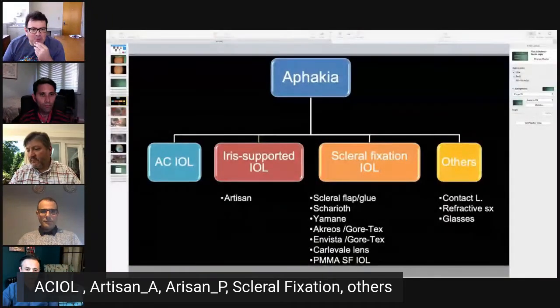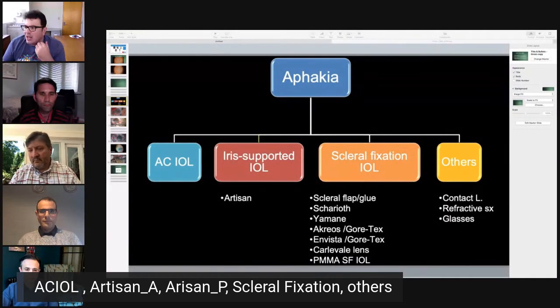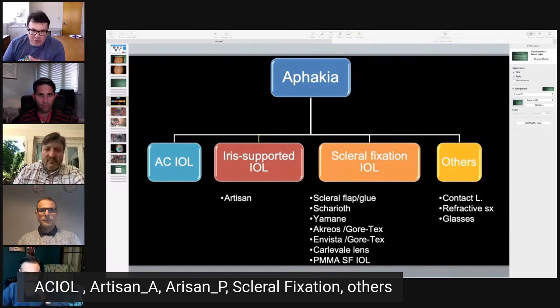Right, that's great. Let's move on to different lenses and what we do with different lenses. We have a variety of lenses. I'm showing here a picture courtesy of Dr. Abdallah Laban, showing the different types of lenses. We have anterior chamber IOLs, iris-supported IOLs, and for completion, you can suture an IOL to the iris, and we have different ways of doing scleral fixation of intraocular lenses.